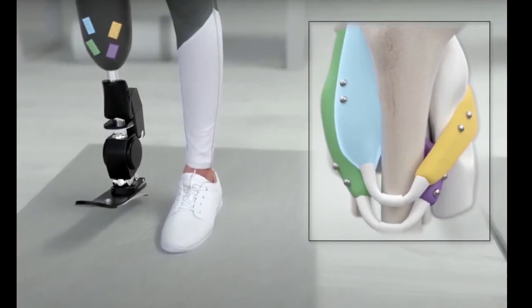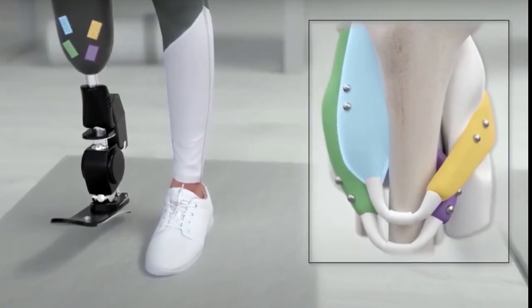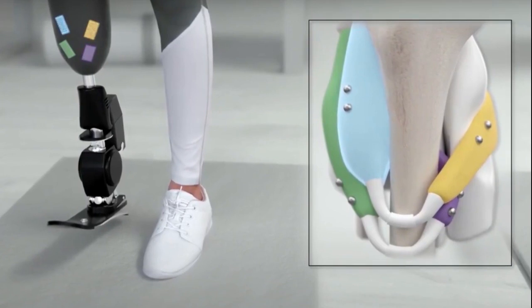Currently, powered prosthetic limbs are usually controlled using an approach known as surface electromyography (EMG). Electrodes attached to the surface of the skin or surgically implanted in the residual muscle of the amputated limb measure electrical signals from a person's muscles, which are fed into the prosthesis to help it move the way the person wearing the limb intends. However, that approach does not take into account any information about the muscle length or velocity, which could help to make the prosthetic movements more accurate.